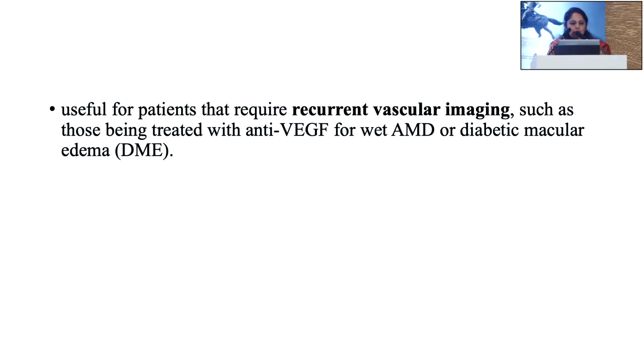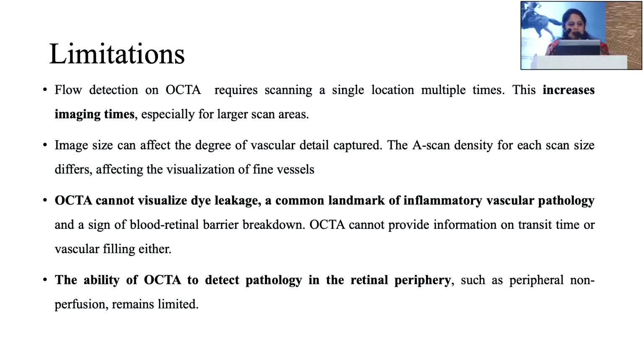We've discussed all these points, and it is useful in patients who have a contraindication to the dye, patients with chronic kidney disease or any other relative or absolute contraindication to the dye. And because it is non-invasive, we can do it again and again. We can do it in cases which require recurrent vascular images, such as patients being treated with anti-VEGF therapy for AMD or DME.